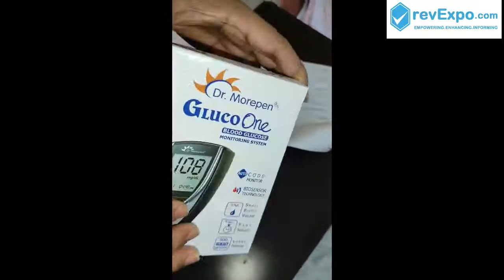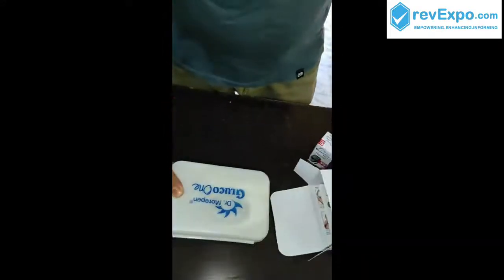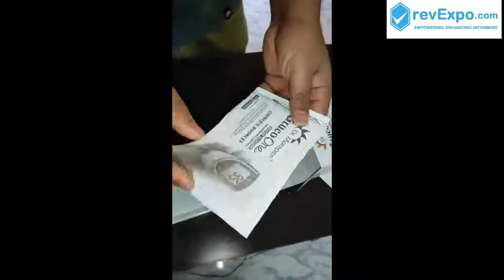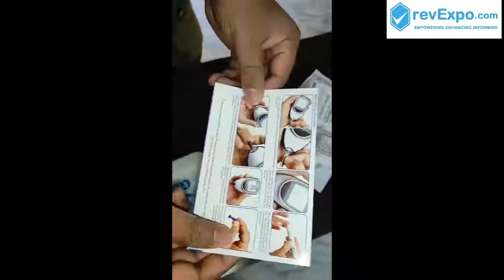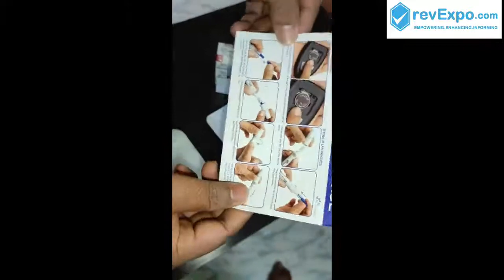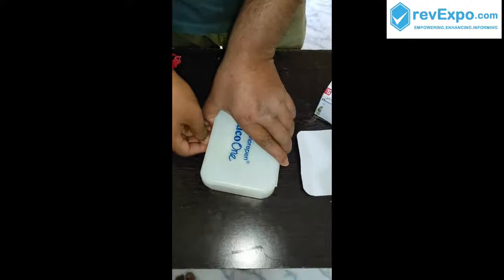There is no seal here. I am opening this box. Here you can get the results within 5 seconds. Here we have the guide on how to use it — here is the instruction booklet. If you didn't get it, you can refer to this. Here are the images showing how to use it, with steps you need to follow before getting the test done.